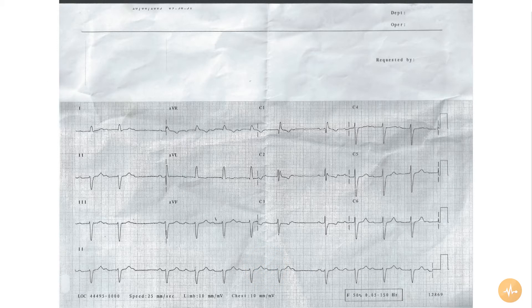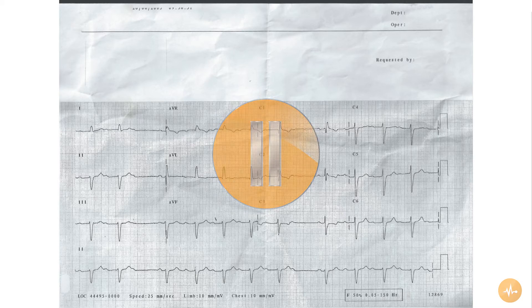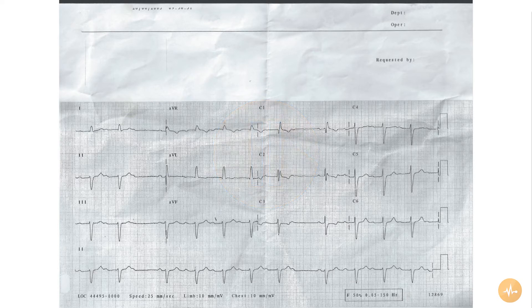This is an ECG recorded from a patient suffering with recurrent collapses. Pause this recording now and interpret the ECG on your own, before pressing play again to hear me interpret the ECG.